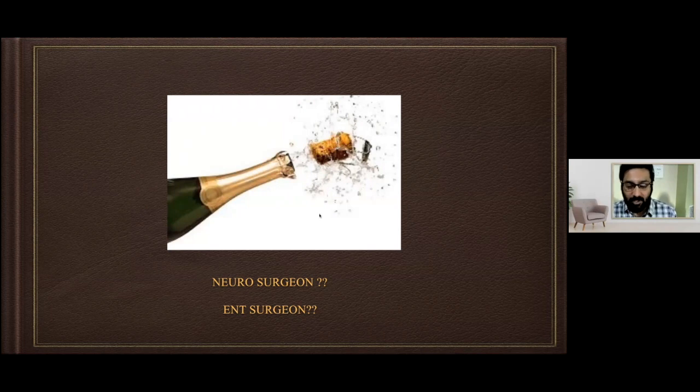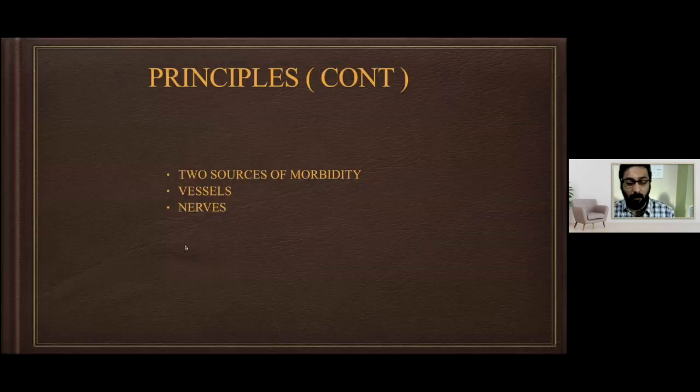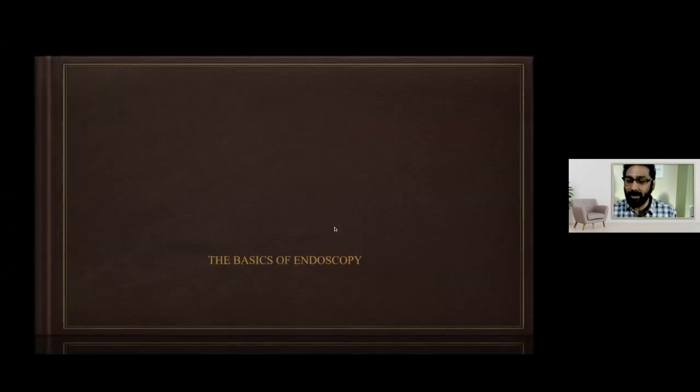So basically, we should understand that endoscopic skull-base surgery is teamwork. It's not one person. So please, my dear friends, when you're doing skull-base surgery cadaver dissection, two of you combine and do it. Never hold the scope and use the instrument yourself. If you do that, you can never progress to doing a lot of complicated cases. Of course, I'm just going on to how to start doing endoscopic skull-base surgery.